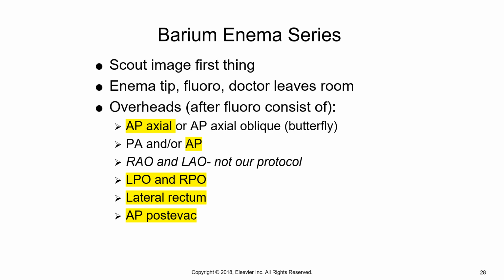So our routine is to do first an AP axial, we call that a butterfly. Then we do an AP. Then we do both obliques, RPO and LPO. Then we do a left lateral rectum. And then on a single contrast study, we always do what's called a post-evac image.